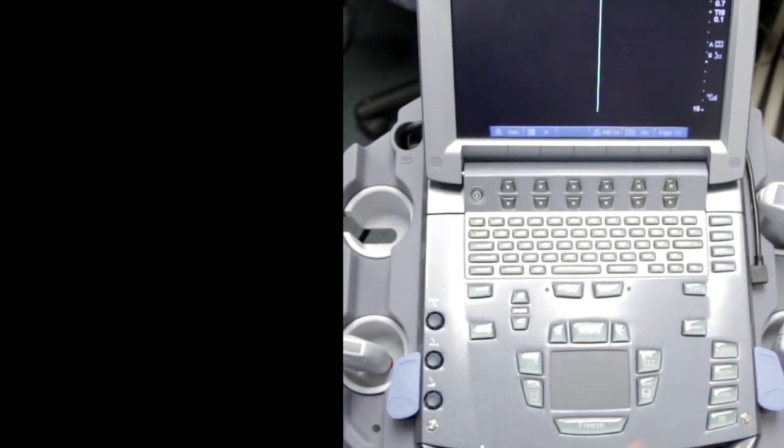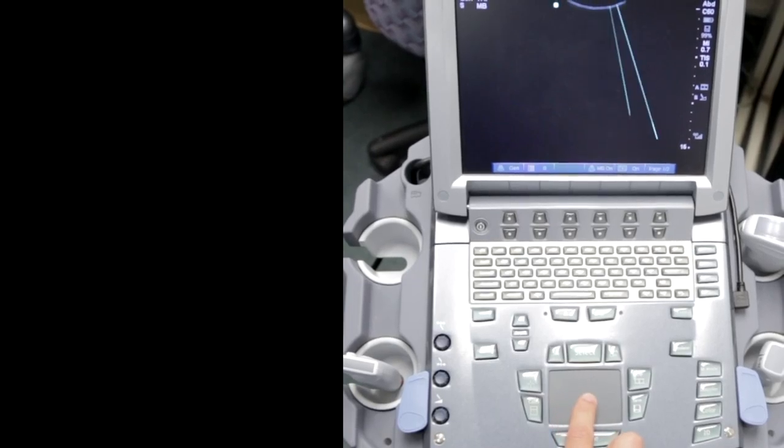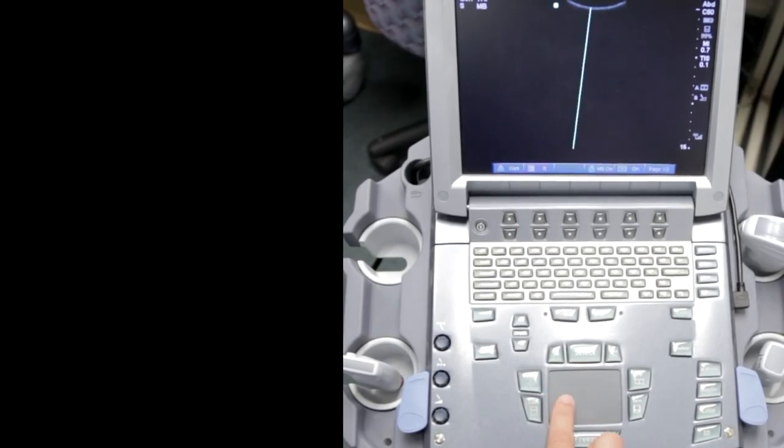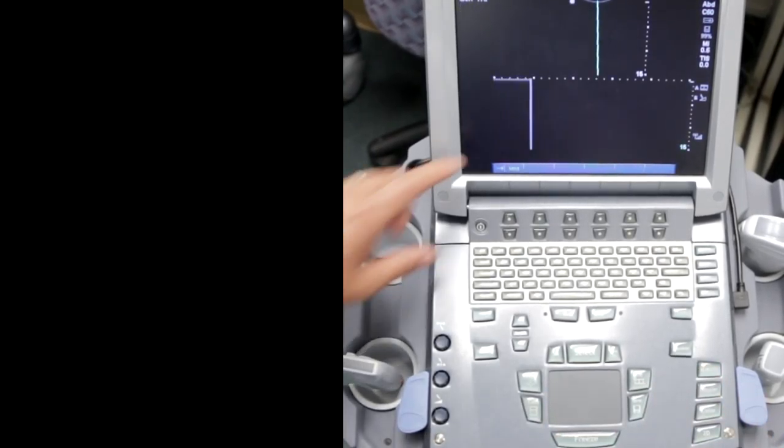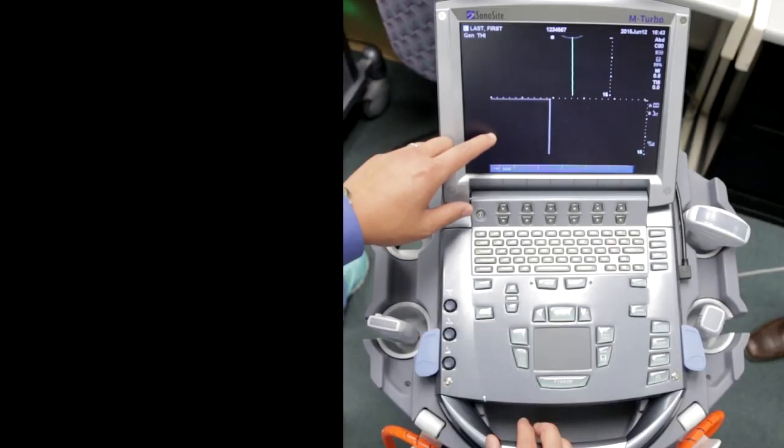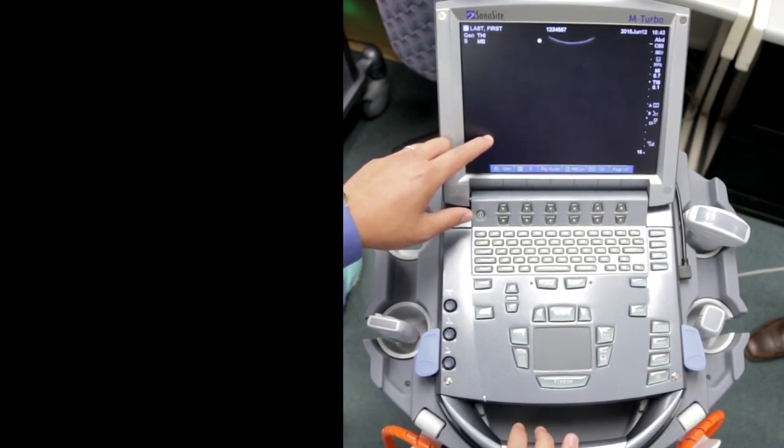If I push M-mode, you have to push it twice. The first one is to line up your cursor, and then when you push M-mode again, that's when it actually activates. If you want to exit, push 2D and it'll go back to 2D mode.